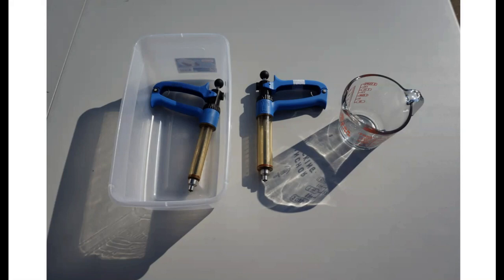And we're talking about the injectable needle here, not the metal transfer needle. The metal transfer needle, I'm going to clean it at the end of the day with my boiling distilled water. The other thing is that metal transfer needle, if for some reason you had more than one type of vaccine you had to mix together, I want a different needle for each one of those vaccines. So I may mix 10 bottles of vaccine together that's designed to be mixed together with that same transfer needle throughout the day. And what I do between times is I'll just leave it in the bottle.